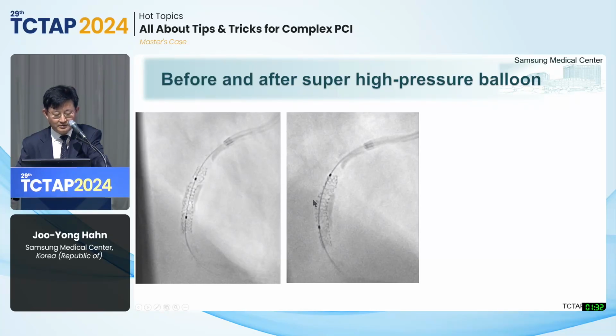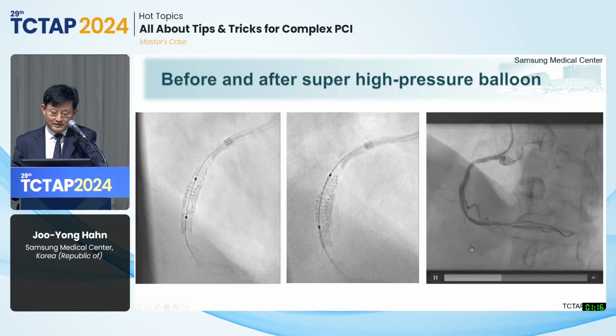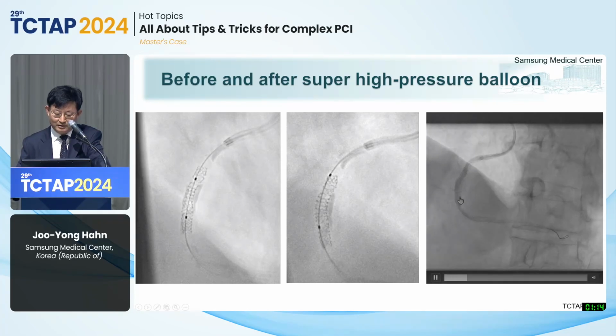The stent expansion was markedly improved, but however, as Dr. Akiko mentioned, the stent expansion was mainly done at the contralateral side of the calcified nodule. I was happy with that, but after injection, I found a micro perforation had occurred at the stent site.